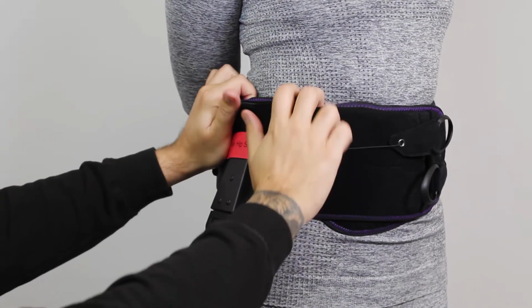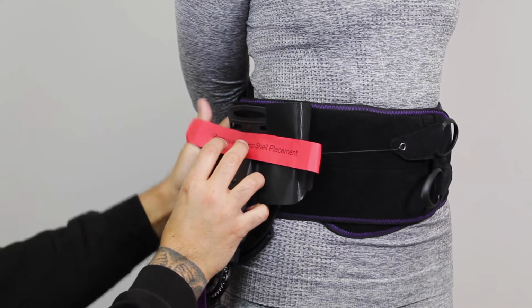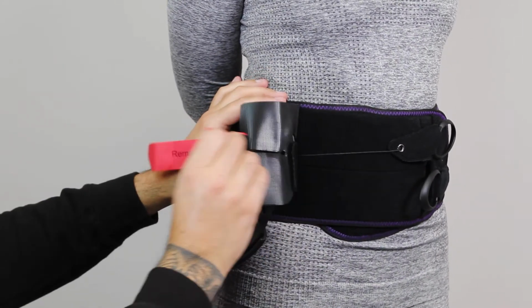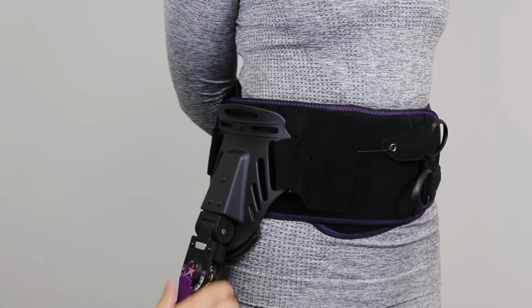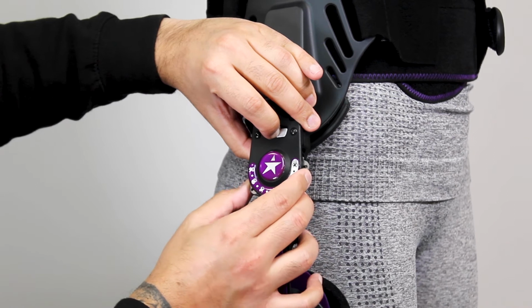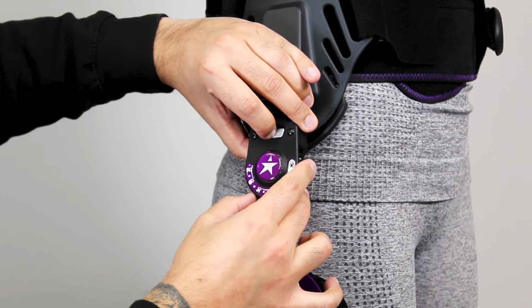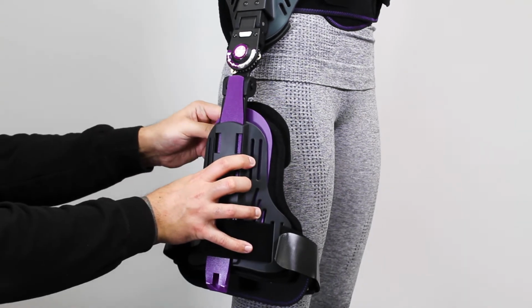Position the pelvic shell and hinge assembly so that it is centred over the trochanter. Once the pelvic shell is in position, remove the red tab to secure the hook and loop. Set desired flexion and extension and lock if required. If required, attach the mid-thigh pad as shown.